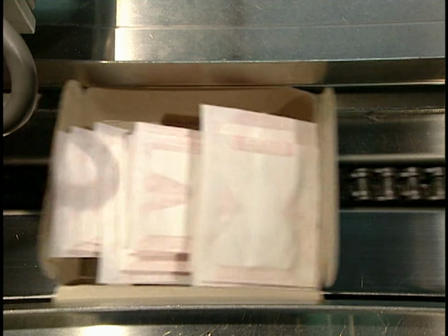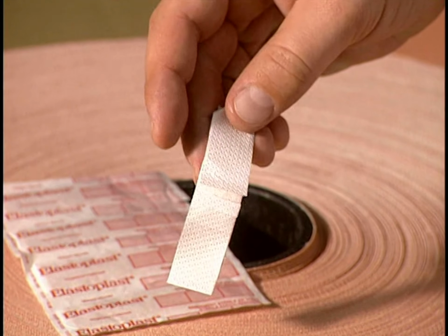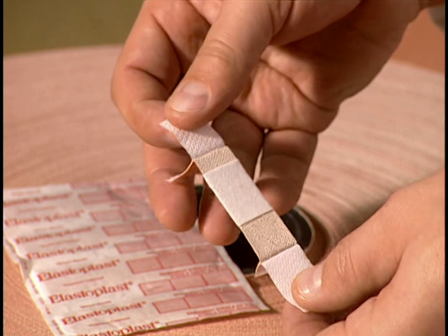The large roll of ETS fabric seen at the beginning will have allowed them to make nearly 2 million bandages. Each year, this facility produces a staggering 4 billion bandages in 65 different models.